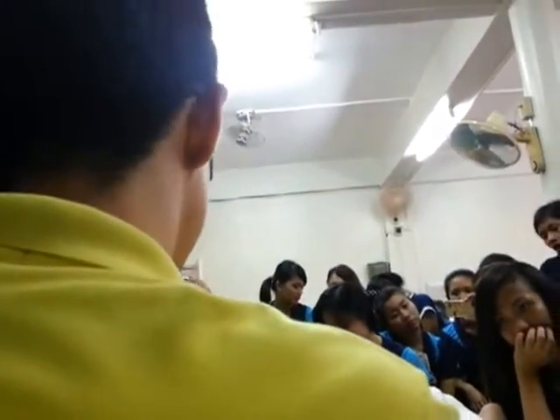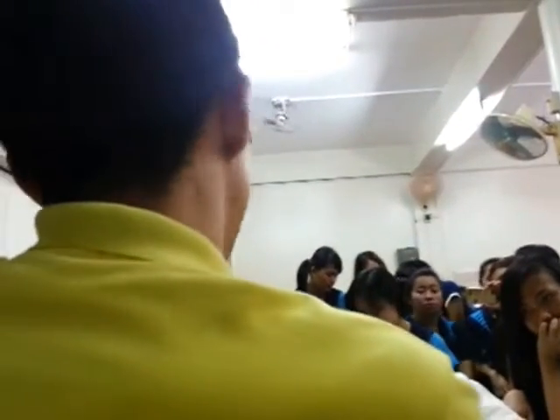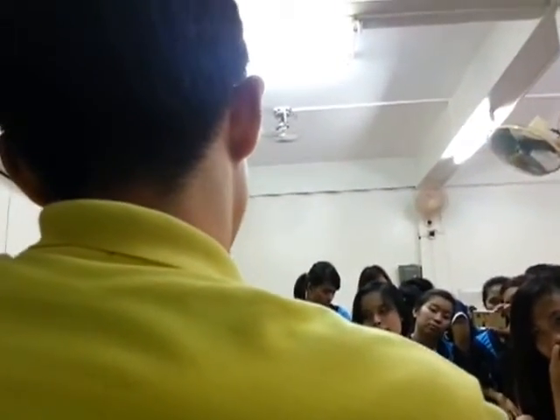So one of the problems is that the patient has weakness in wrist flexion because of the flexor carpi ulnaris, as well as movement of the little finger. So let's just say we want to stimulate the flexor carpi ulnaris.